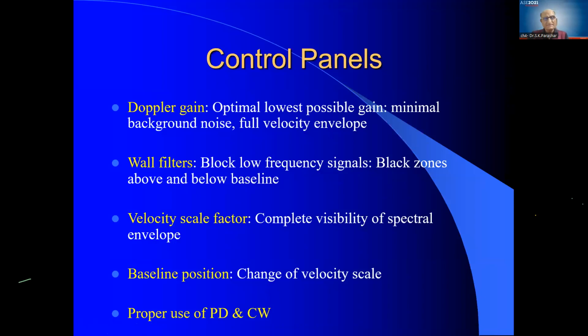So I think this will be better understood by you when you see a live demonstration of gain, filter, and velocity scale also. I think, Dr. Oja, what we can do is next Friday, we can keep a live demonstration of all these modalities, including knobology.